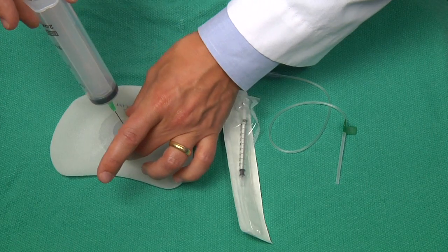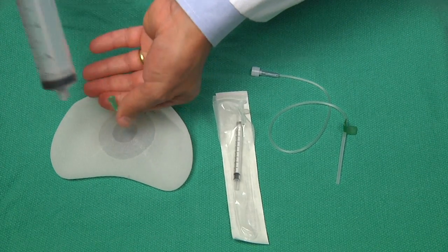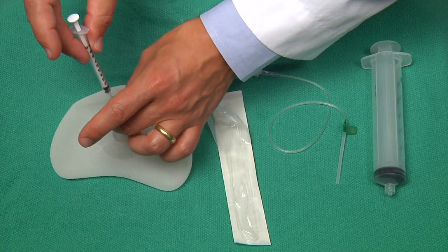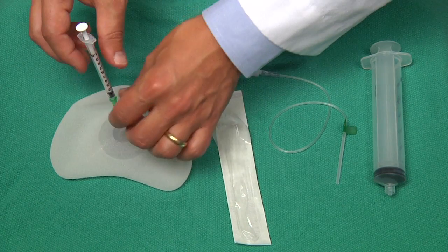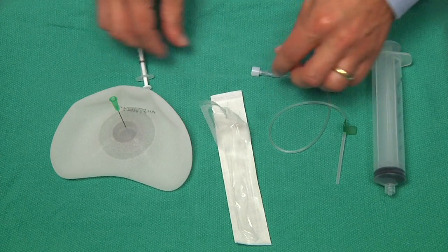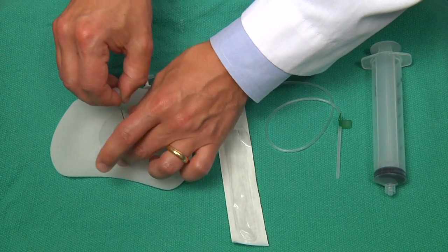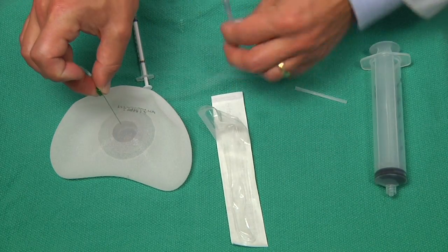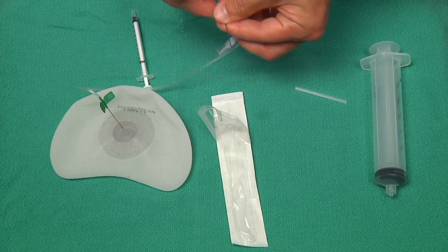If more than 60 cc is required there are several options: one is to re-inject after refilling the syringe; another is to leave the needle in place and cap it with a 1 cc syringe; or to use a butterfly needle with a cap to seal it off while the 60 cc syringe is refilled; or alternatively to start from the beginning with a fill tube with a cap or a one-way valve.